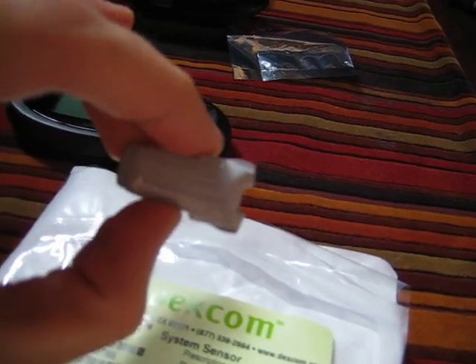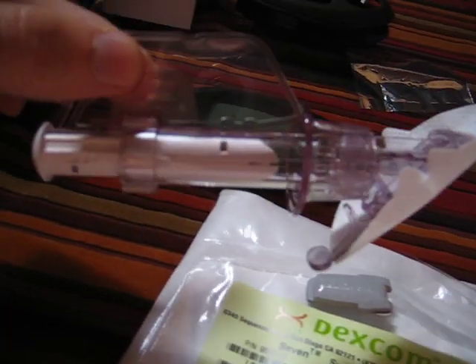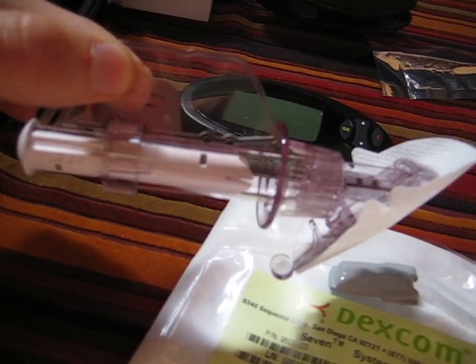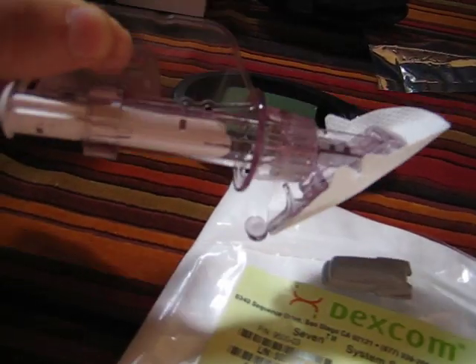This is the transmitter, not the transceiver. And then this little gizmo is the — well, any number of ways of phrasing it — it's a sensor applicator, or introductory needle.